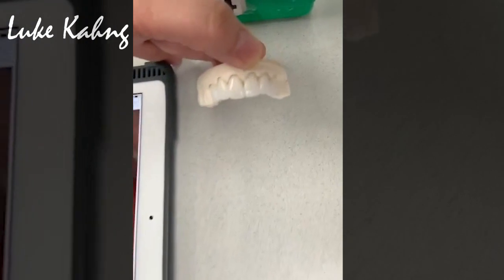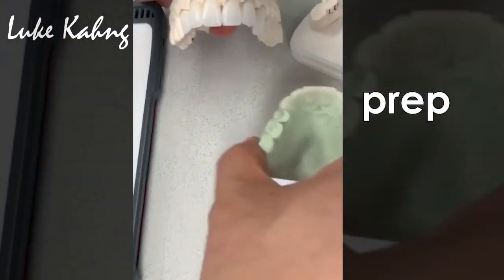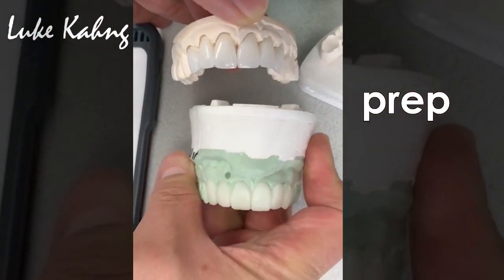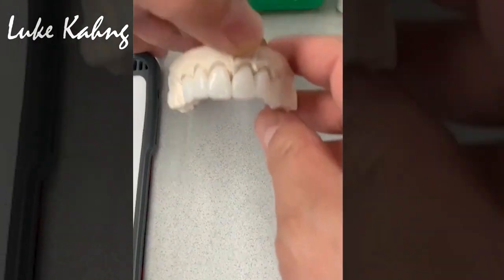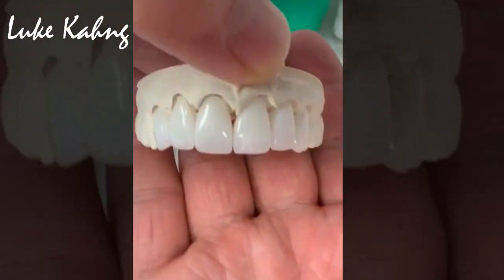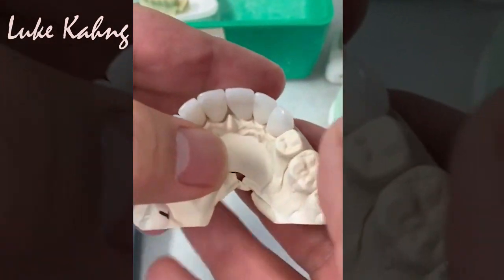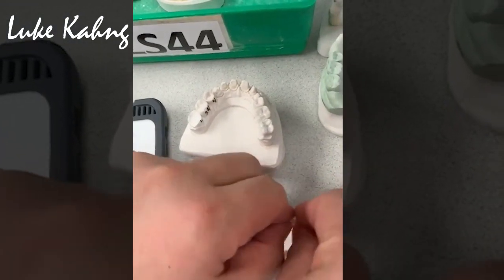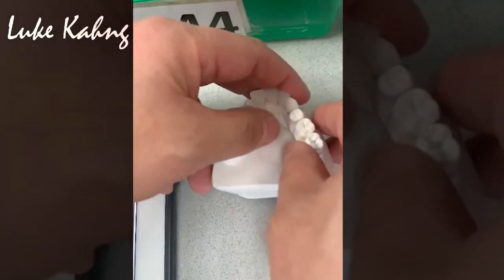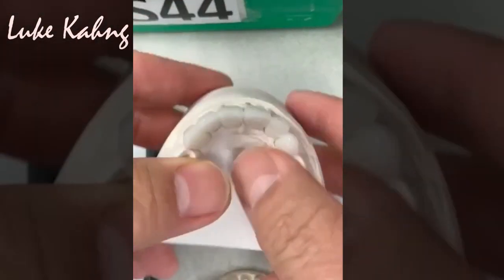Now, the doctor gave us the case, and then we made the good temporary prep for him previously, and then we gave them a prep guide. He does really nice prep, and then this is the final restoration, which is a little bit of a hard time to figure out the size, but it looks really good. This is the cast model, which we mounted with the dental articulations. This is what it will be.